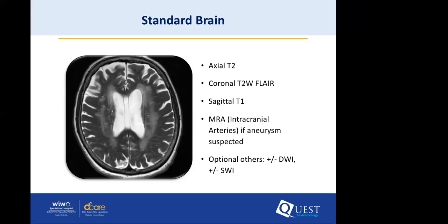So I tend to keep these sequences to a very minimum when this is a standard screening image. I don't really go into it, but I look at the clinical history and I might add one or two sequences like diffusion and SWI, but generally I limit it to the top 4 sequences. So it's an imaging box of sequences you can go to at any time, and most of the pathologies you will try and identify with these sequences.